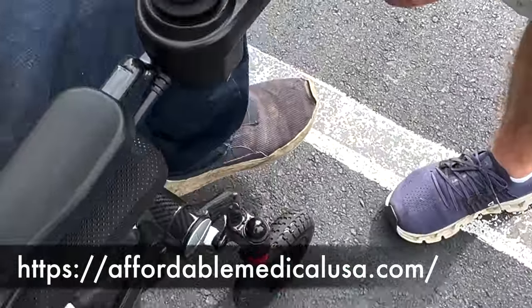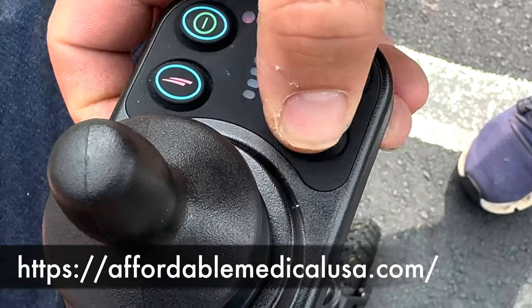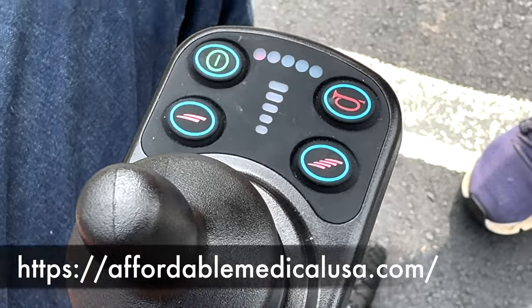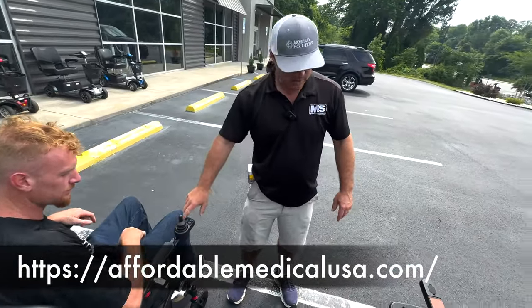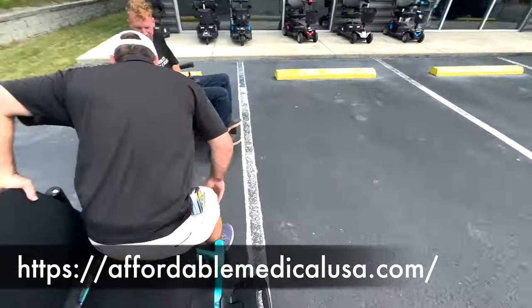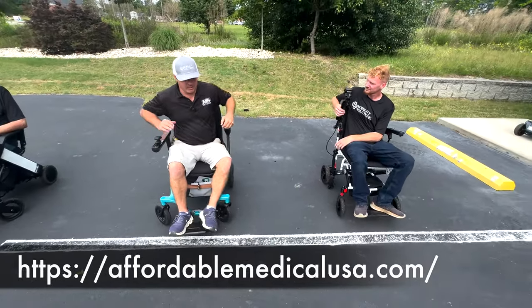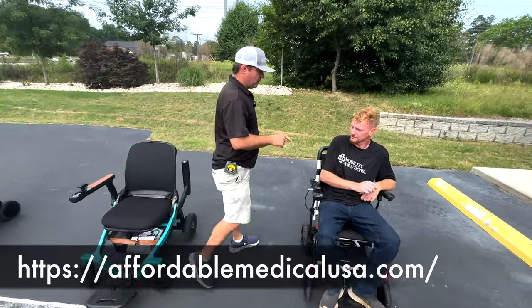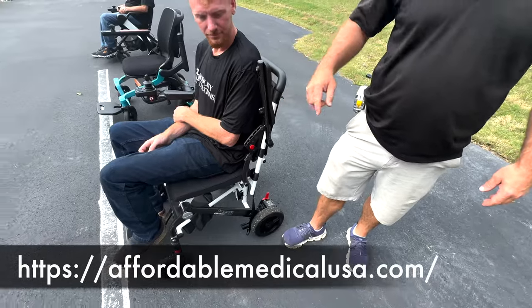Over here, you got your speed. It beeps. Power button, horn. You don't want to put a lot of weight on this to get up. Getting into these can be a little bit easier if you don't want to do the foot plate. By like this and coming around and bringing this down. It's easy movement. You can put your hands here, put your hands back here to get up. You can do the same thing with this one. Just flipping that back. Turn this way, Josh.